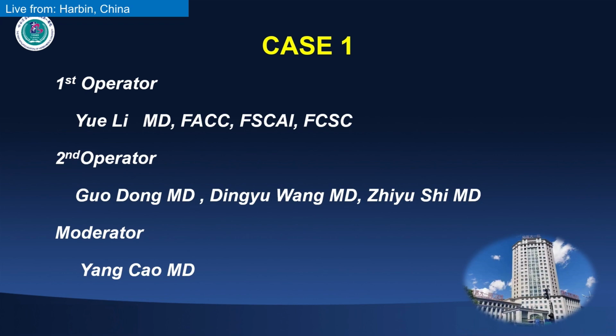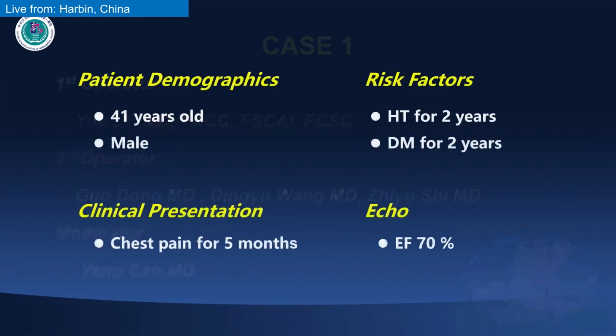And next, please allow me to introduce the leading operator of today, Professor Li Yue, who is the vice president of our hospital. Today we are going to demonstrate this very complex CTO case, which is on a second attempt this time. Next, I will give the time to Professor Dong Guo, the second operator, who is going to introduce the general information of this patient.